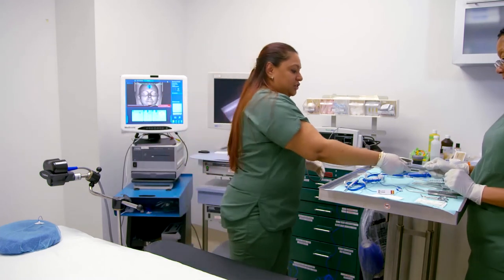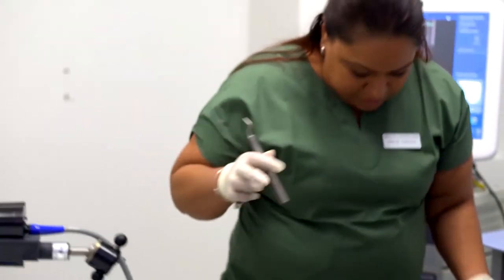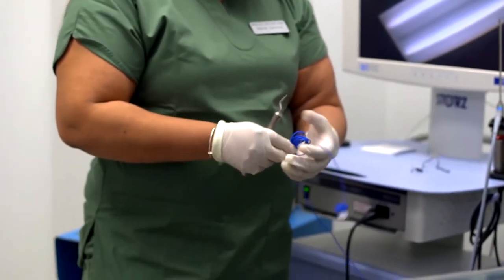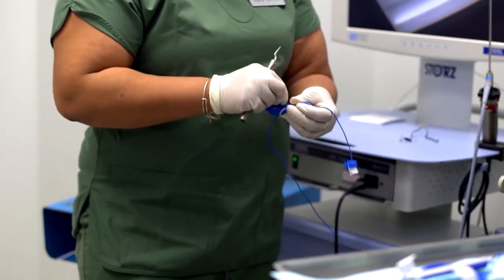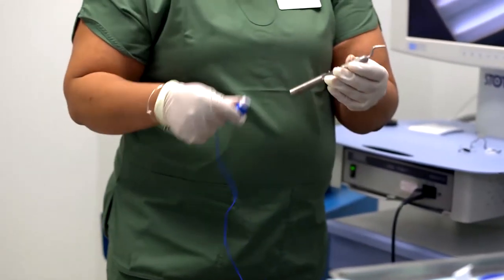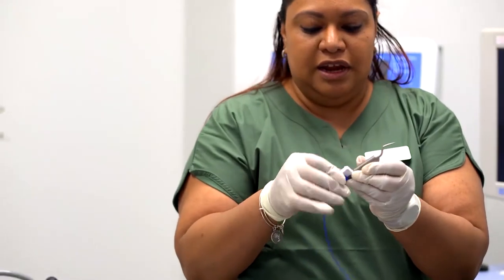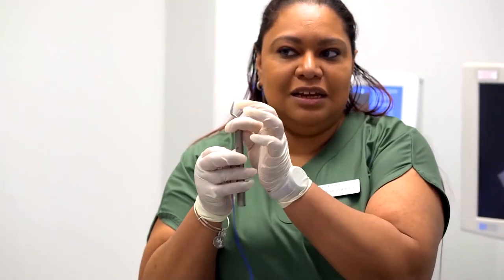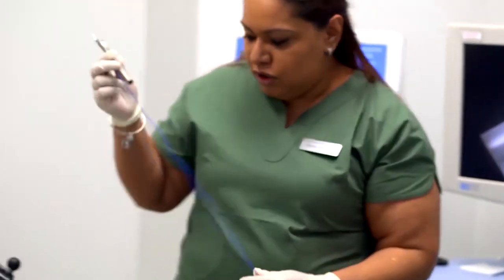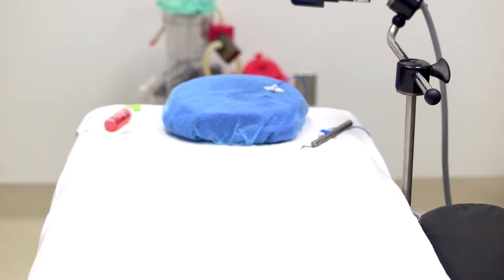And then the registration tool is another thing that we connect so that when the doctor's ready to come in and do her procedure, everything will be ready and set to go. Just gotta make sure that you align this with the two little holes here and that you hear a click. And that tells you that it's ready to go. We also put this on the table so that it could be ready.